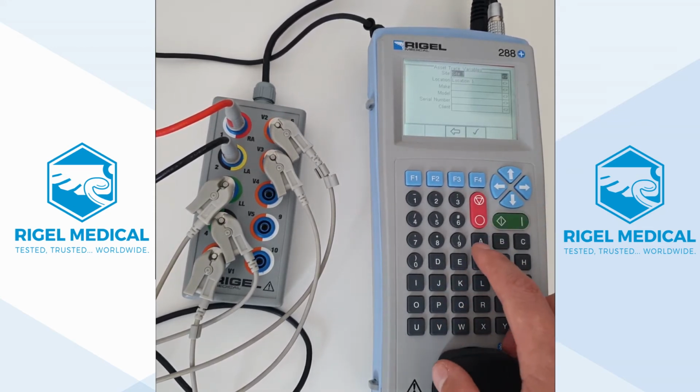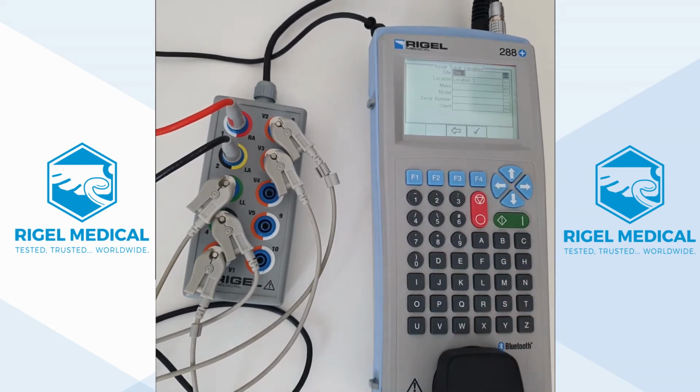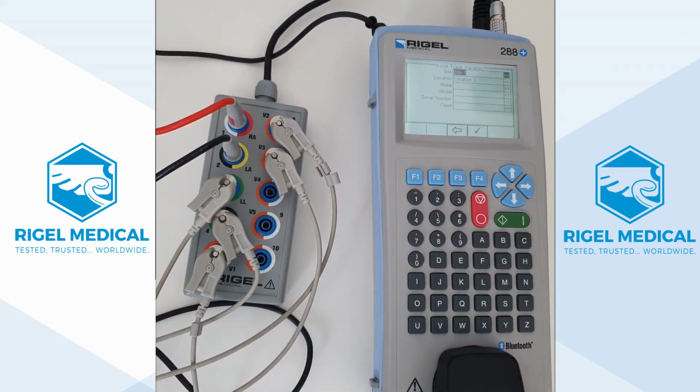We'll put in our asset variables. I won't go through this now. I have a webinar planned in 2 weeks' time, which will go through the user interface and how to carry out these automatic tests. And we'll also look at how to set up test codes, which is how we set our number of patient connections per device.